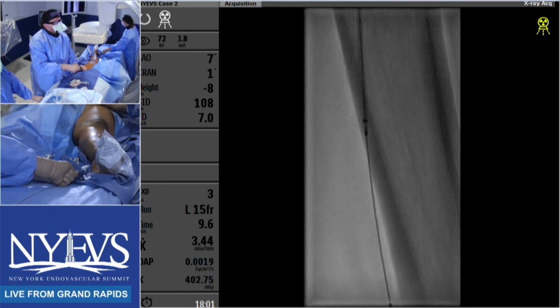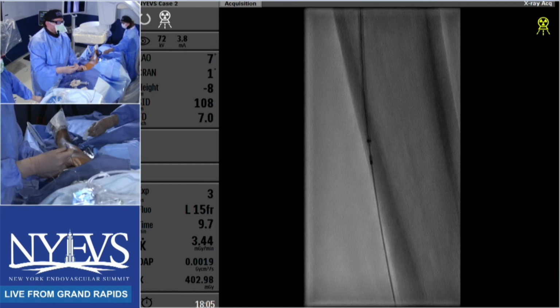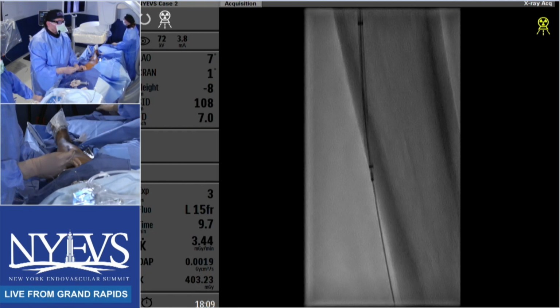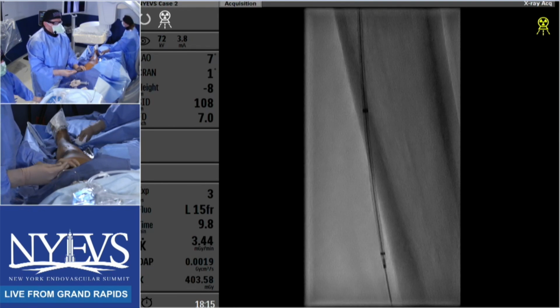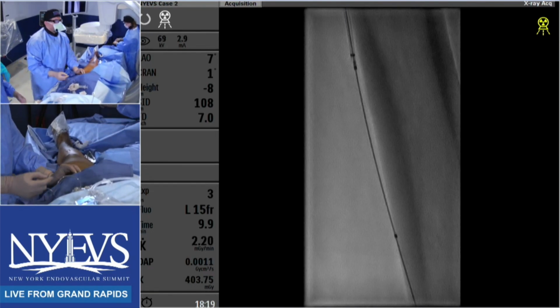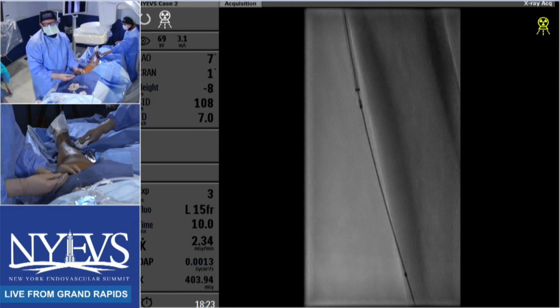And I think, Brian, you bring up a good point for the fellows. There are close to 80 fellows here as well. And one thing you have to realize is that with angiography, oftentimes you get an underappreciation of what's really there because of hibernating vessels and so forth. What I always tell people is, sometimes you have to start your recanalization and you'll get a little bit more robust flow distally. But this is a great example of what you're talking about.